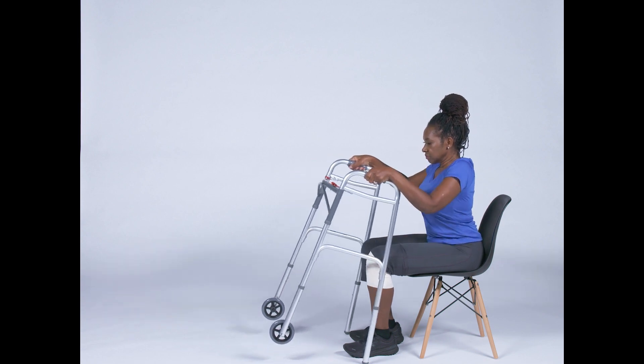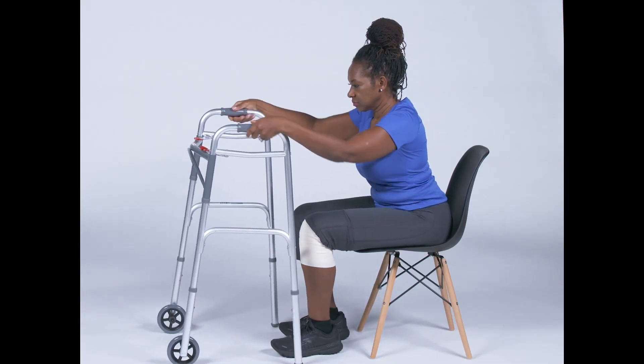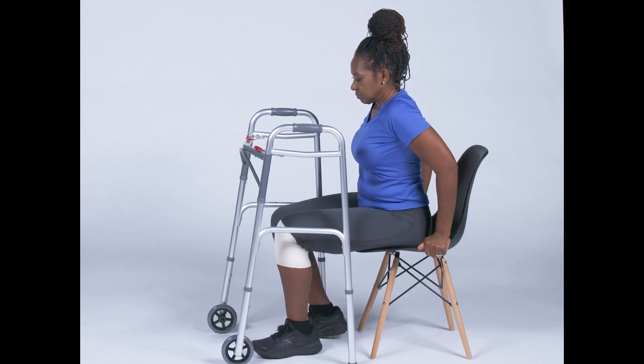Do not attempt to stand up by placing both hands on the walker and pulling. Instead, start by placing the walker in front of you. Next, shift your body to the edge of the chair.